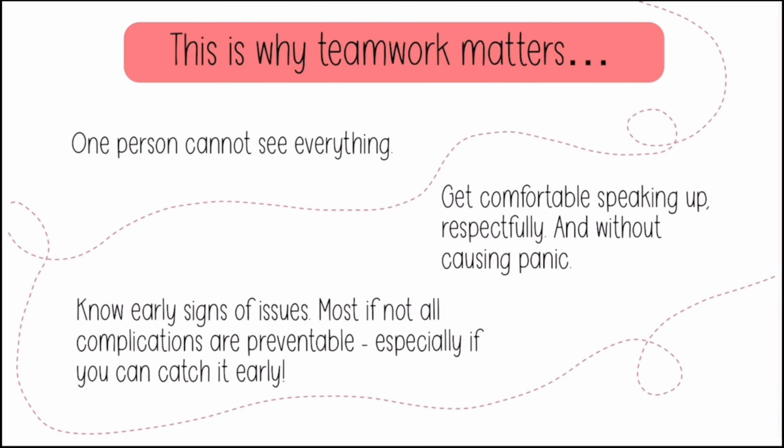One person cannot see everything, including the physician. They're paying attention to what they're trying to do. There's so many other things going on, and they're hoping and trusting that someone speaks up if something abnormal goes on. So get comfortable speaking up respectfully and without causing panic, because remember, the patient is awake and they can hear you. So choose your words wisely. Learn what works for the team to call attention to something. And know early signs of issues. Most, if not all, complications are preventable, especially if you can catch it early.